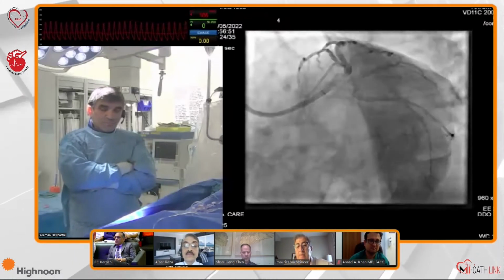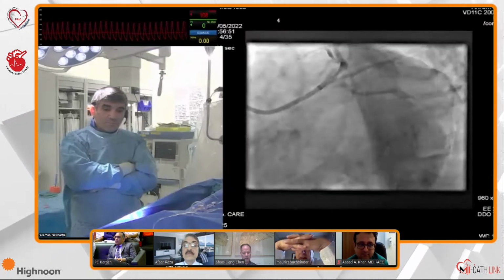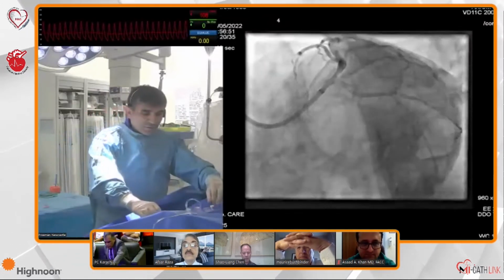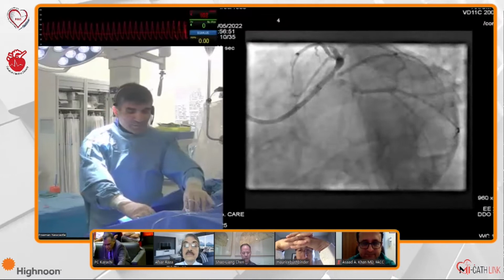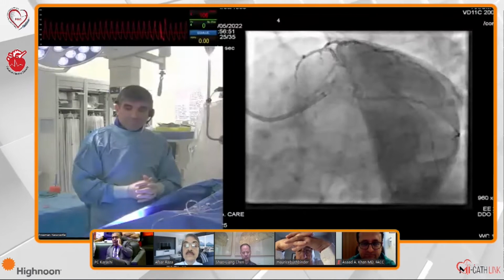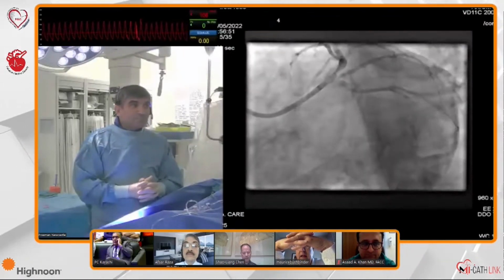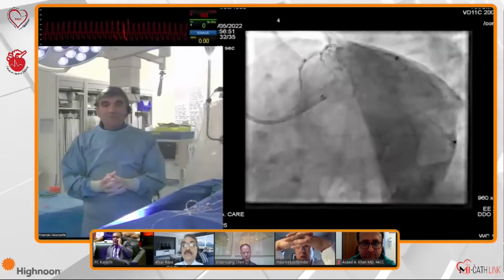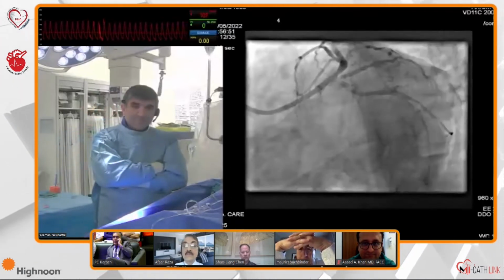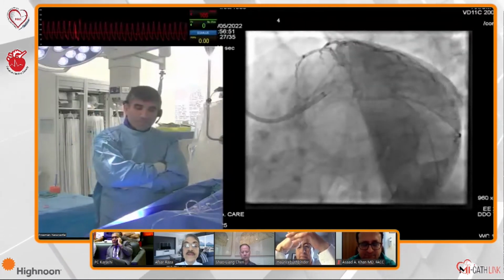So I would probably use a 2-stent strategy, prepared with rotablation probably. First with balloons, and then see if it opens up well with the balloons, cutting balloon, then no need to. Otherwise I'd rota it. So you'll try with the balloon first? Yes, there's no harm. If you go with rota upfront, then obviously you can only have one wire and you'd have to choose which vessel you want to do. And if that's the case, which vessel would you choose? If you're asking me which vessel I choose for rota, I'd probably do a rota to the circumflex.